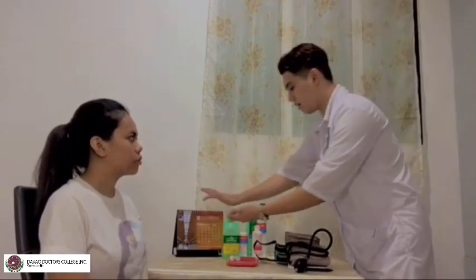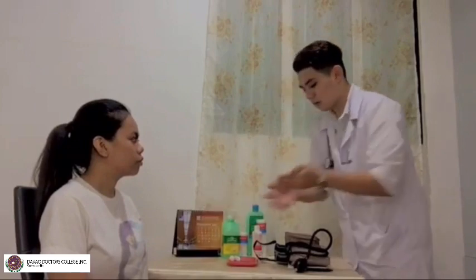Okay, first, before assessing this, we need to have proper hand hygiene. And also, we are going to clean certain apparatuses, and of course this one later.